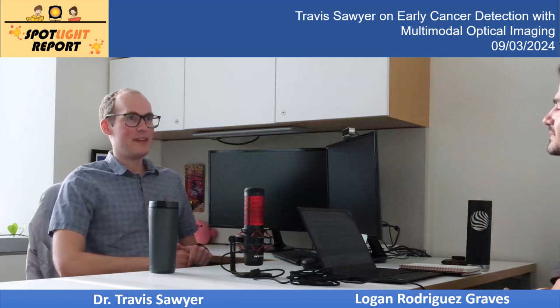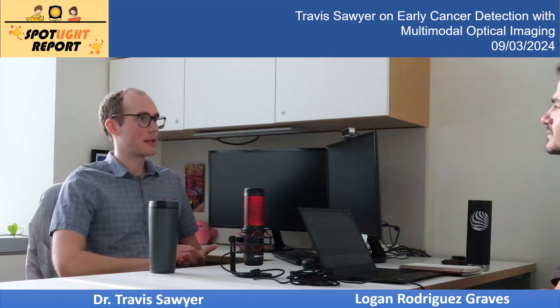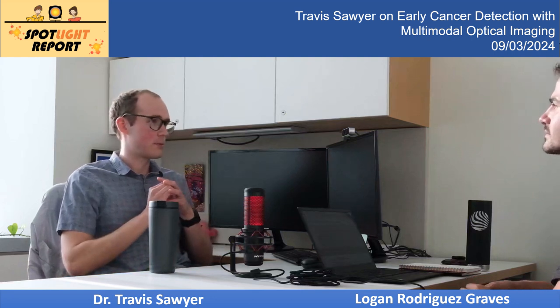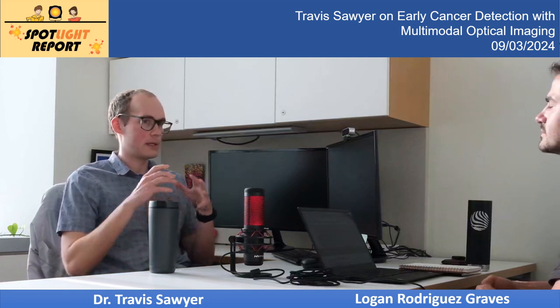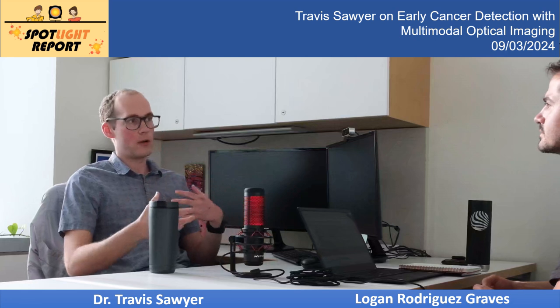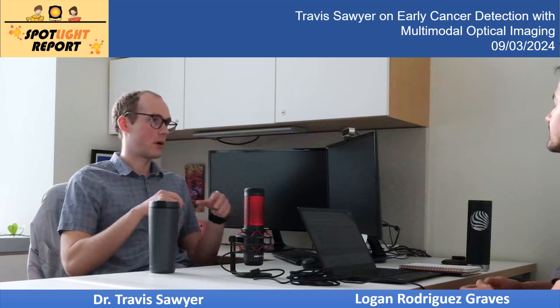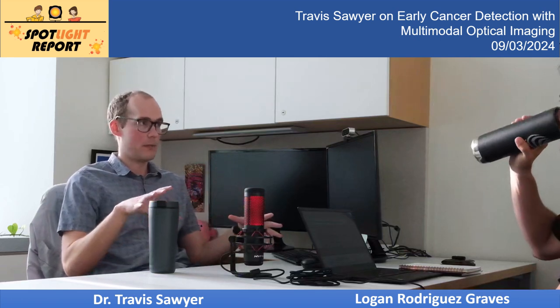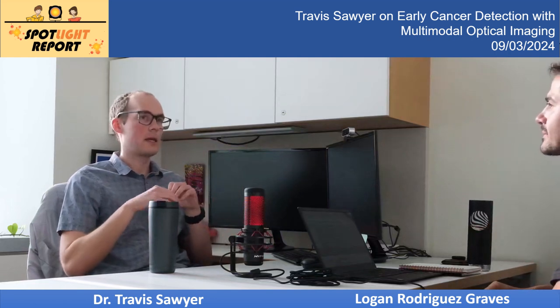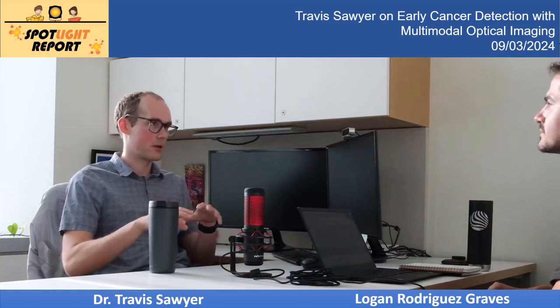Yeah, great question. So the barriers to translation are variable, and I think it depends context to context. In some cases, it is that the technology is not mature enough yet. I think that's probably the case with multi-photon, is that the idea of implementing some kind of clinical handheld multi-photon device, it's not quite there yet. I think multi-photon systems tend to be big, bulky, expensive. You can't wheel it around in a little cart. Yeah. We are getting there. I think some people have made some really amazing miniaturized systems, but it's not quite there yet. I think that's also a case where working distance, it's pretty sensitive to that, and so it's a little bit harder to control.